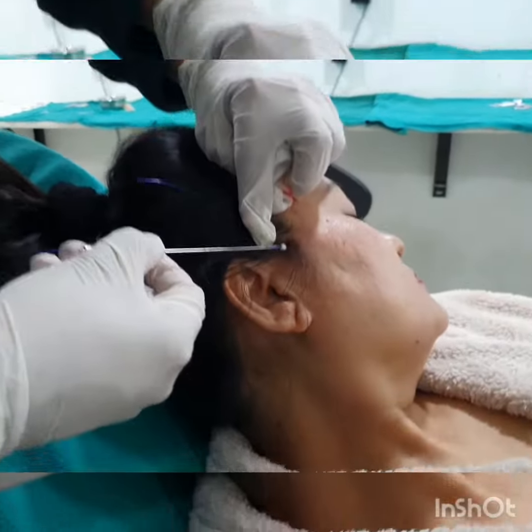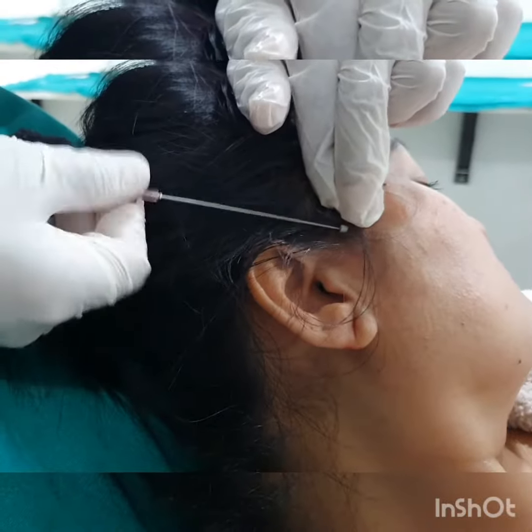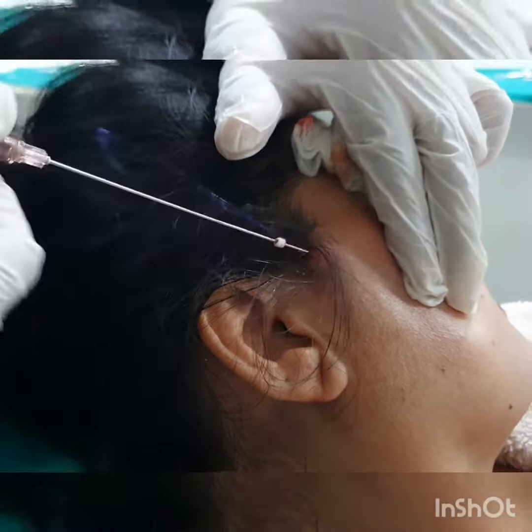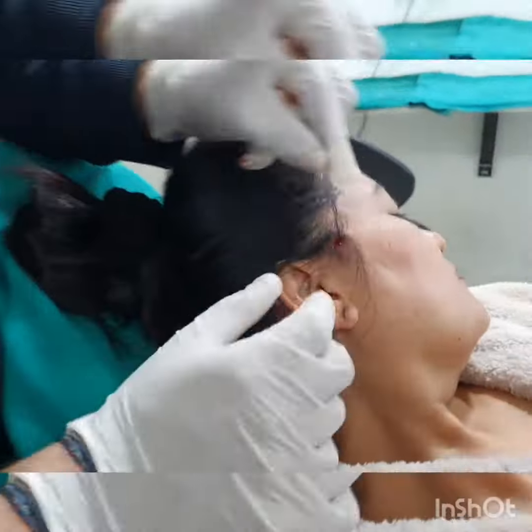Then we pass the second thread, which is passed in the direction of the angle of the lip. The idea is to pull up the angle of the lip in order to improve the sagging of the lip, and this also pulls up the lower jaw and improves the jowls tremendously.